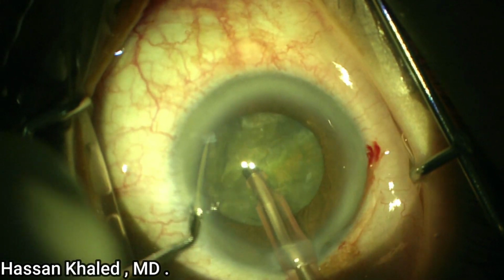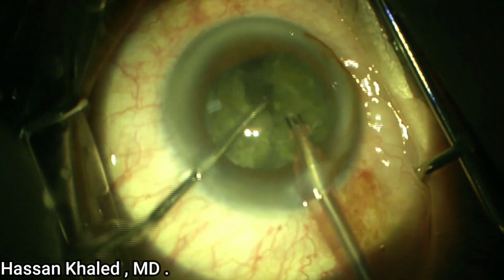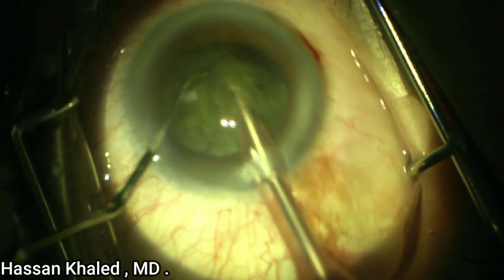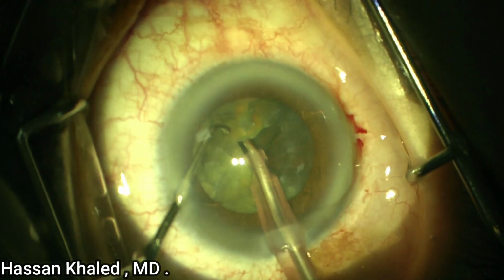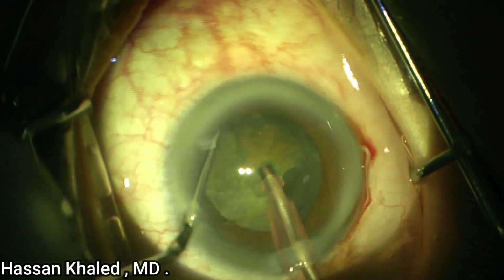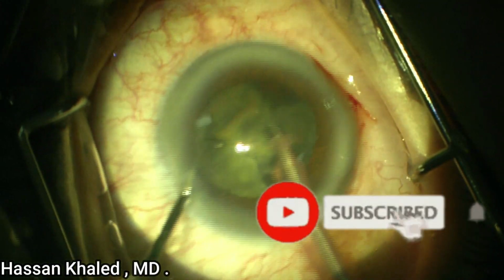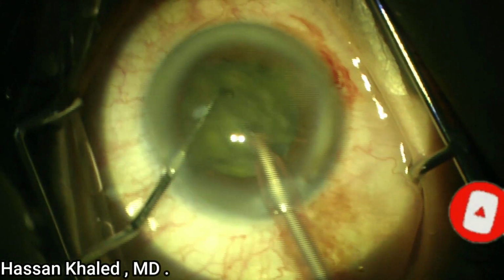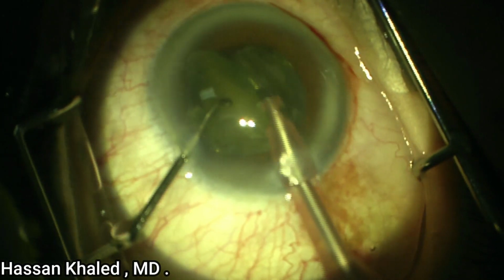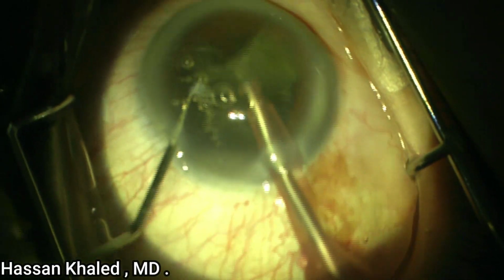Then you can repeat this way again and again and chop this nucleus into smaller pieces and hold each small piece and lift up to the supranuclear space and emulsify it at the level of the pupil. Here you can see holding and emulsifying, and sometimes you can chop it into smaller and smaller fragments and emulsify at the level of the pupil.